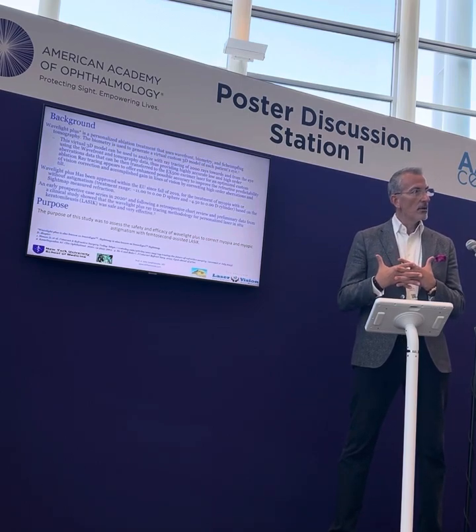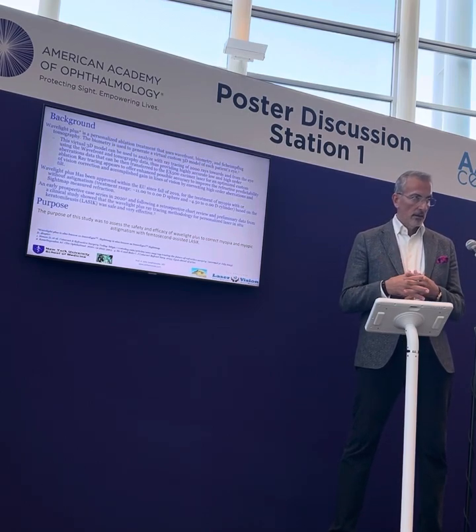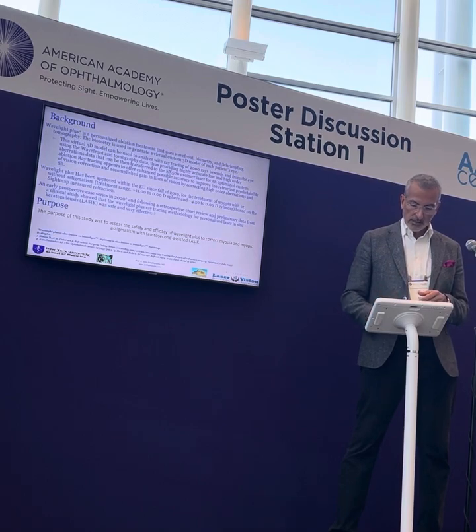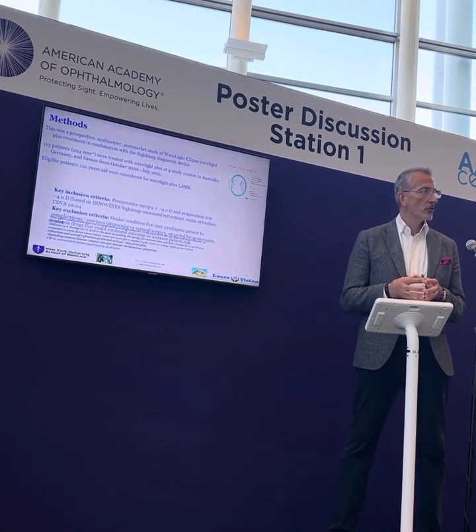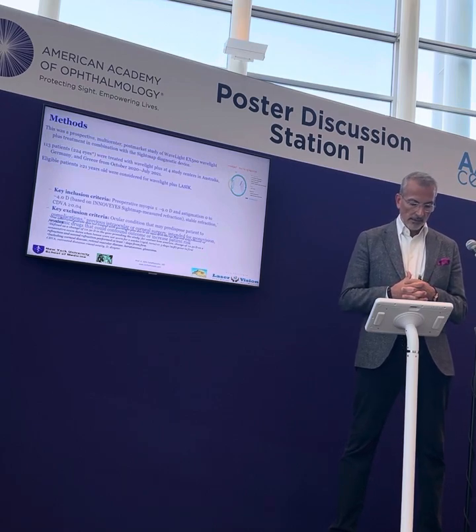So we have this 3D model eye, and then it uses, we'll see it in our next slide. Obviously the purpose was to evaluate in this multi-center study a large number of patients who went to have myopic or myopic astigmatic LASIK.